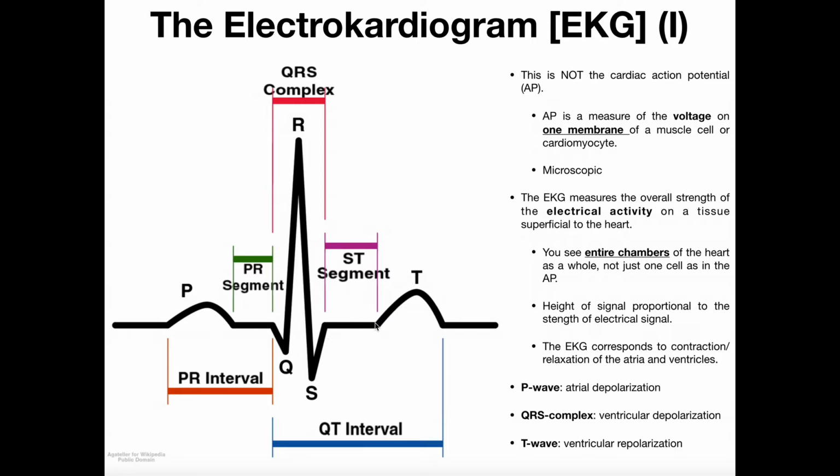All right, now we have a final wave here called the T wave. The T wave is the final signal in each cycle of the electrocardiogram. The T wave is ventricular repolarization. Okay? So this is when the ventricles are relaxing and ultimately when they're triggered to undergo diastole, or the filling phase. Now, the T wave itself is electrical, ventricular repolarization. However, we would expect the mechanical event to follow the T wave would be ventricular diastole, which is when the ventricles are relaxed.